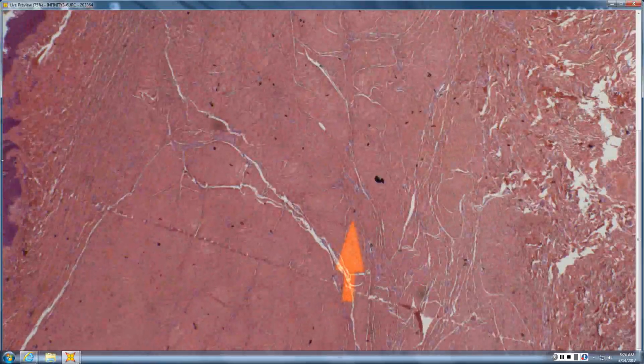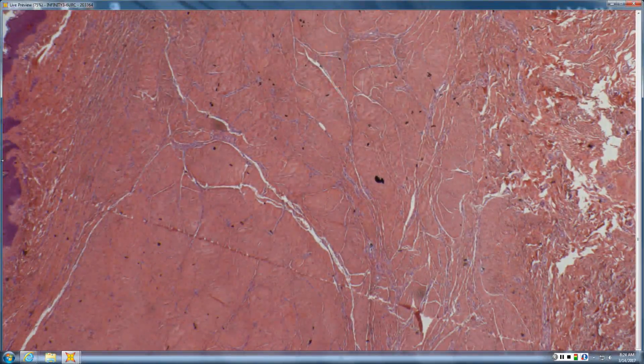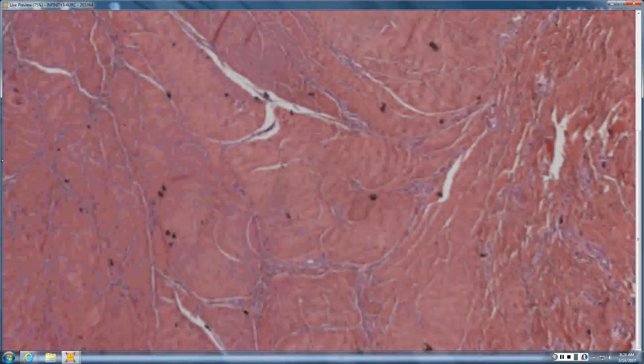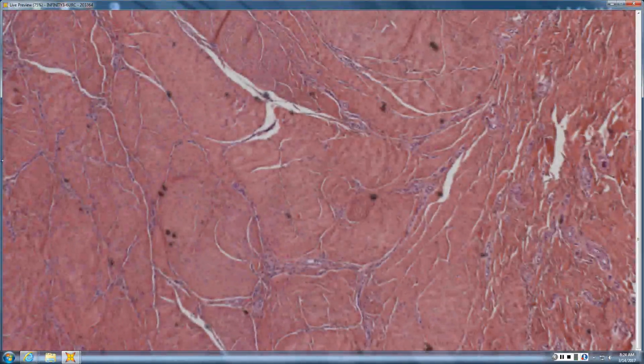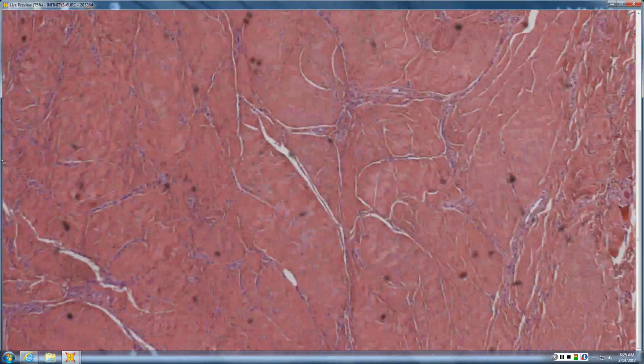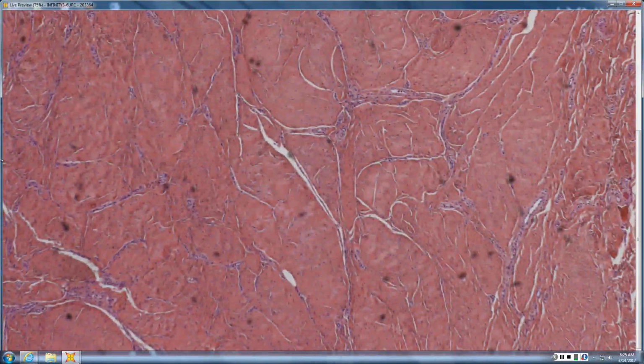There's that scar tissue in there. Keloidal, like collagen. So is it bubblegum keloidal, or are they more just whorls and nodules within the scar? Just whorls and nodules in the scar. There's just so much of it that I thought we were getting into keloid territory, but that's not. Yeah, but you don't have the bubblegum collagen, and so as the whispers implied, this was hypertrophic scar. Very good.